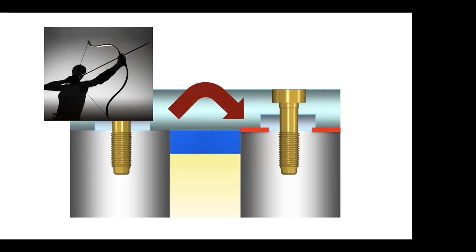So this frame is in constant tension. It tries to go back to where it was, so it's in constant tension like an arrow again. So the only force holding it in its position is pretty much the clamping force of the screw itself, and it's constantly trying to rebound. And that'll make the screw in tension, which is called preload again.